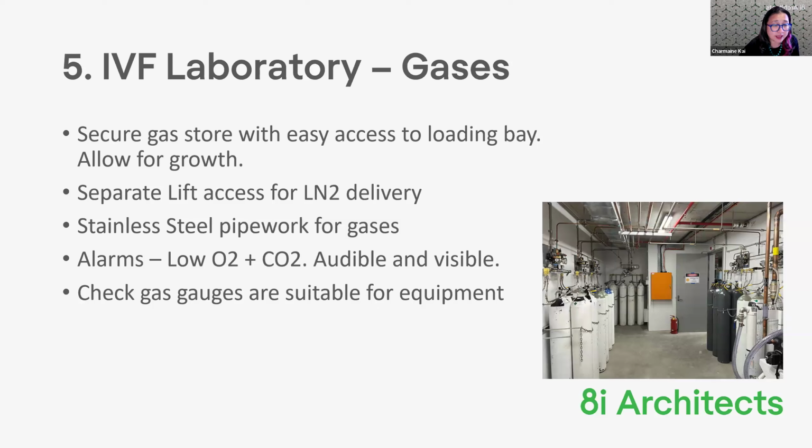With the gases, the actual sensors for the low oxygen should be at around 1.2 meters to 1.5 meters in height. That's where those sensors should be, because if it's low oxygen, that's basically the level of most people's heads. The high CO2 sensor, because CO2 is a heavier gas, will generally be about 300 millimeters off the floor, so it's much lower. So if there's a buildup of CO2, then you know that there's a problem there.